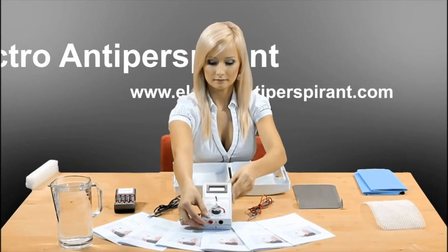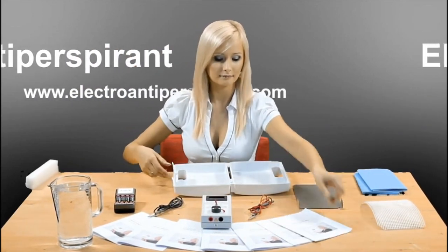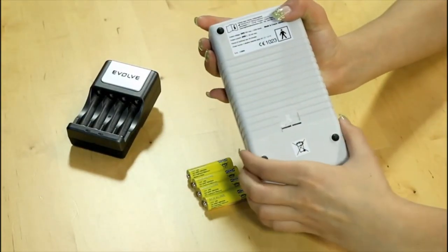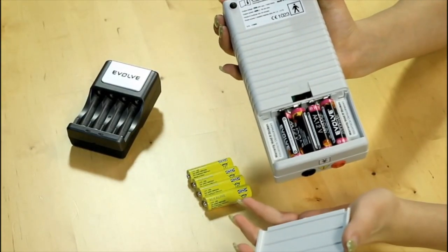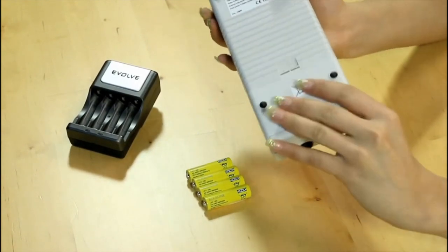Naturally, detailed instructions for use in all languages are contained in the package. Electro Antiperspirant is powered by 4 AA batteries or rechargeable batteries, which minimizes the cost of the therapy and enables the device to work in any household and ensures safety.